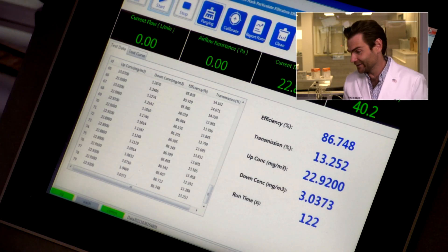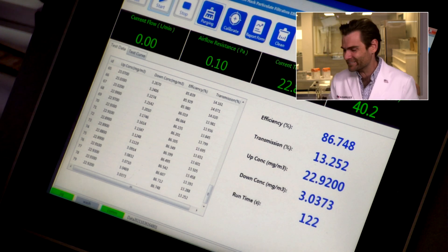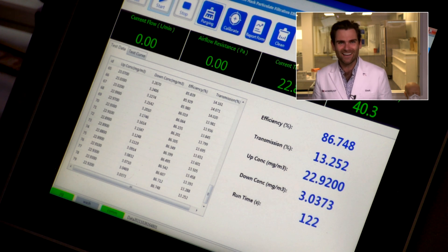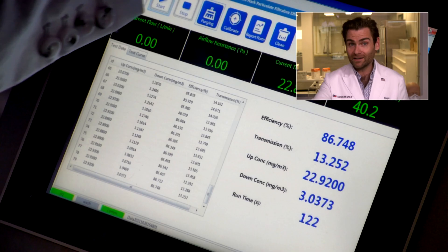Let's see — I haven't actually looked at the filtration result yet, so we're going to do this together. It's worse than the adult one: 86.748%. The crazy thing is Jennifer Garner — she has kids — and she's promoting these masks, and it fails very simple parts of the standard.